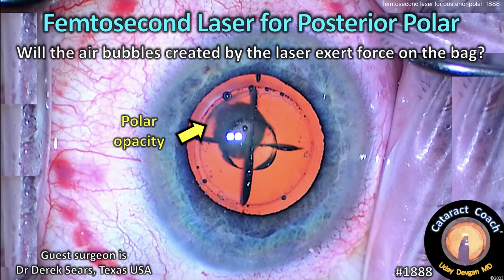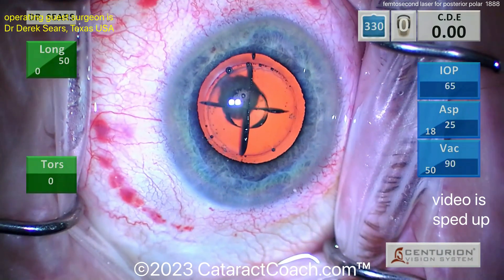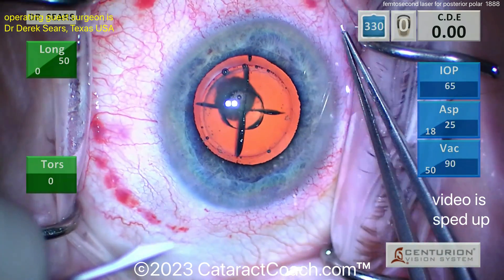cataractcoach.com — femtosecond laser for a posterior polar cataract. Will the air bubbles created by the laser exert a bad force on the capsular bag? Let's watch and see. You can see the laser was used to create a five millimeter capsulotomy.